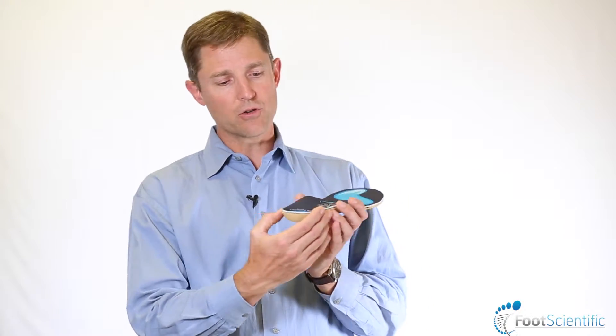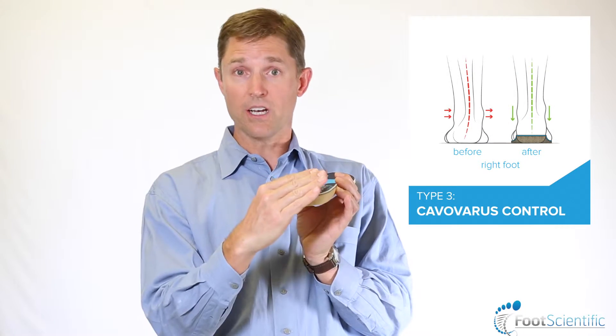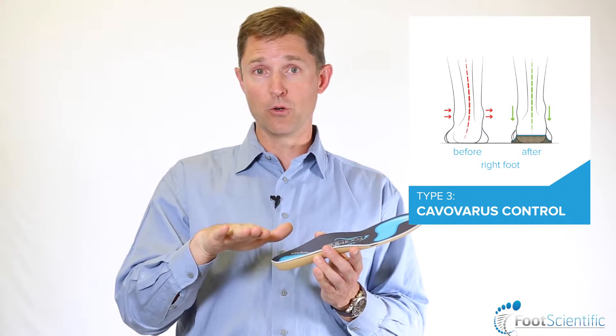A type 3 orthotic, which is the cavo varus orthotic, is one that we've designed to really counteract the high arch foot forces. What we've done is create an insert where the outside edge of the orthotic in the heel is thickened or tilted upward to counteract the forces on the outside of the foot and tilt the foot into a neutral position.